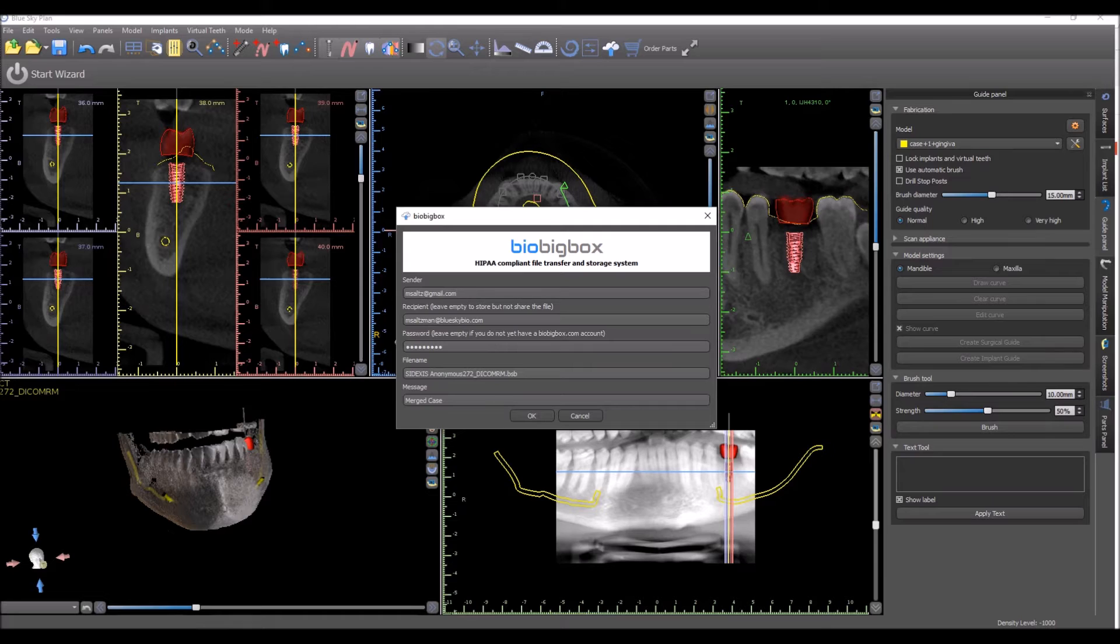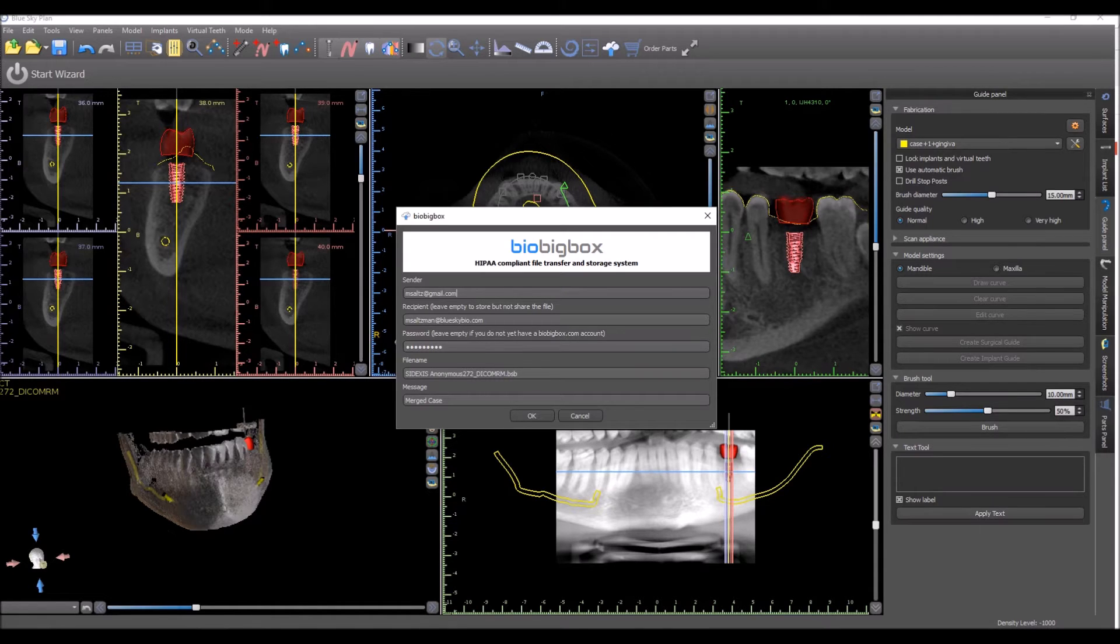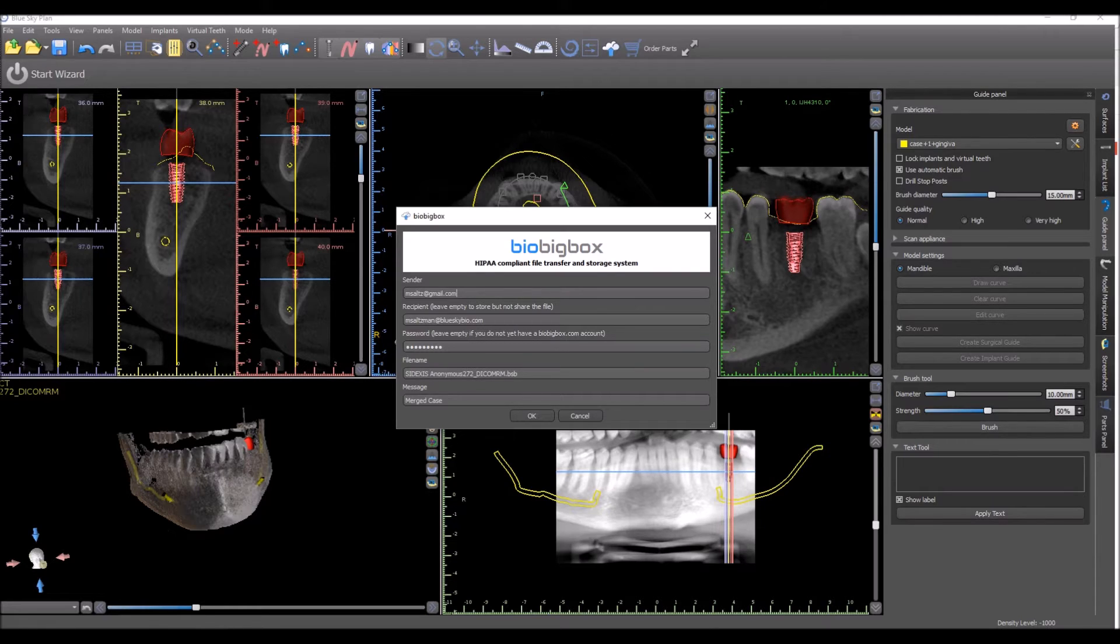If you don't want to send the file to anybody and you just want to have it accessible from your BioBigBox account, then leave that field empty and it will go into your account and it won't be shared with anybody at this point.